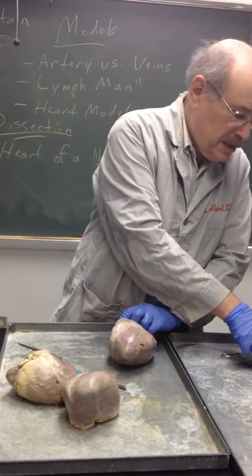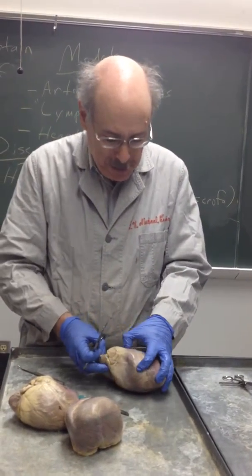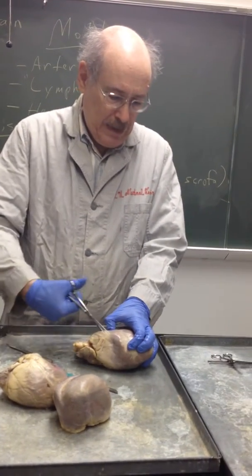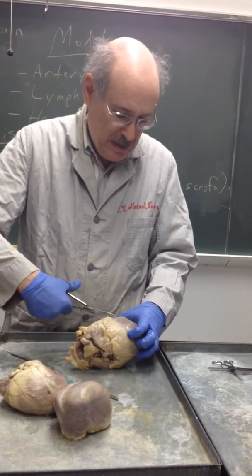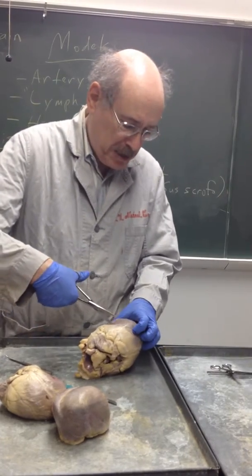All right, complete the incision by putting the lower blade of the scissors in the line you made with the scalpel. That's what I'm doing here. And you keep bringing the lower blade in a superficial direction. That way you're hopefully cutting only the outer wall and not the deeper structures you want to see.